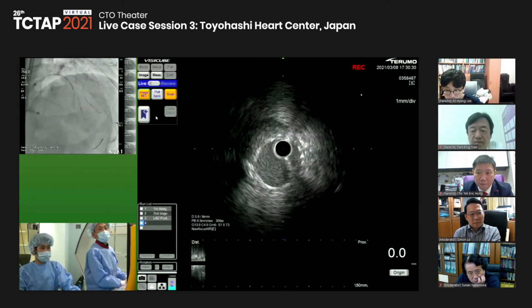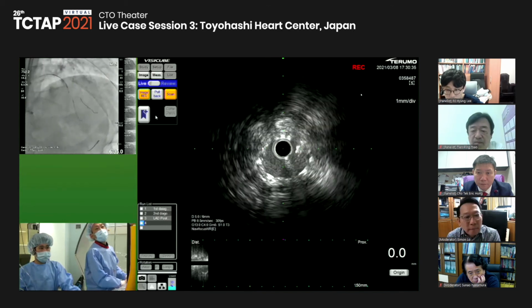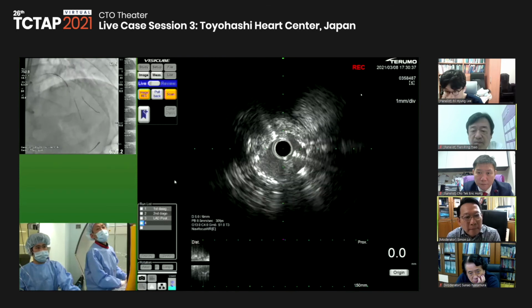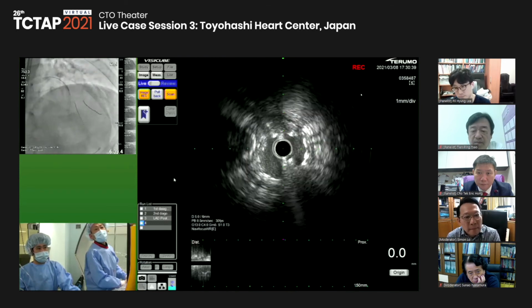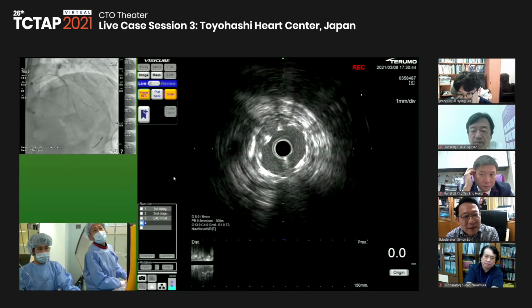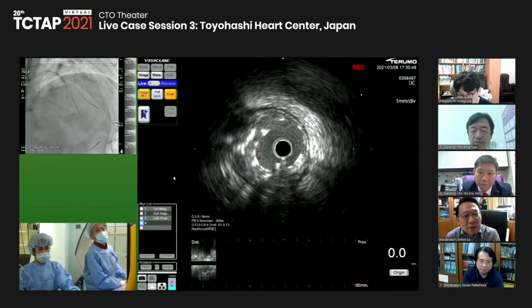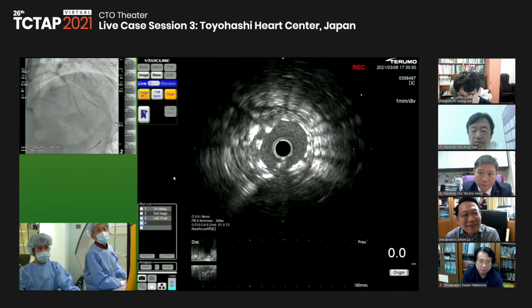So here is the first diagonal stent. Wire here. So we cannot see a clear space. We are not sure. Maybe 12 o'clock is the space we can see. But anyway, the position is very bad, so we should dilate.